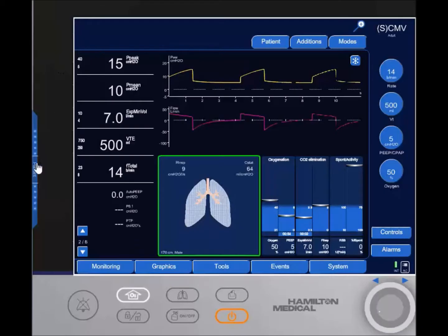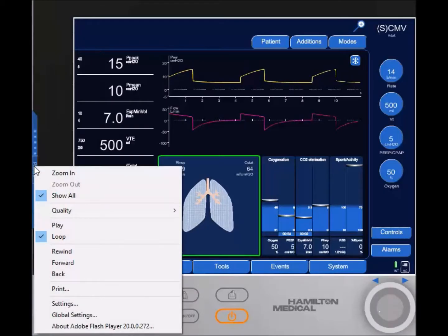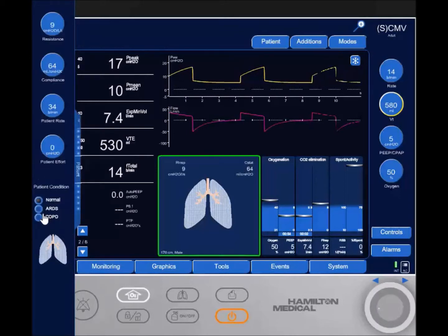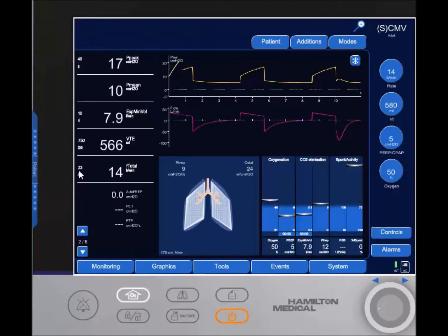So I'm going to have my patient, let's change it over. If you're ventilating me at approximately 8 cc's per kilogram of ideal body weight, say I was a normal surgical patient, you're giving me around 8 to 10 cc's. However, I get sepsis, get an infection from the surgery, and now I get ARDS. So I have ARDS and my lung mechanics change. And I change that over.